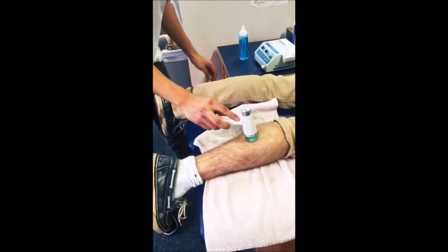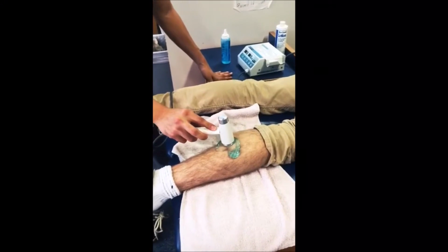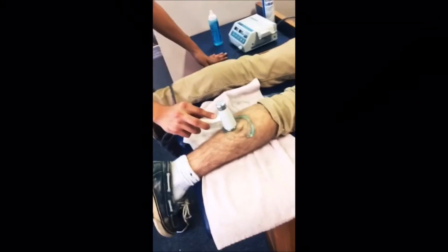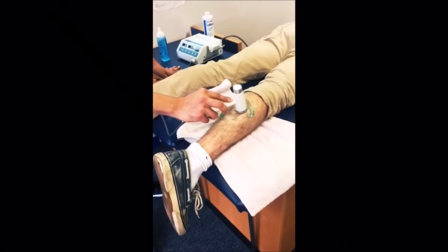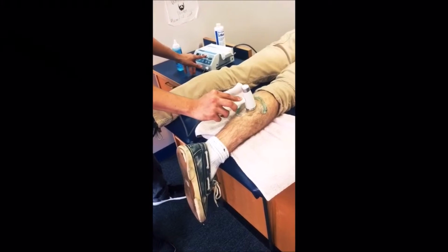Place the transducer head on the patient and start treatment. Be sure to always move the transducer head in small circular motions along the area you wish to be affected. Remind the patient if they are ever uncomfortable throughout the treatment to let you know. Intensity may be raised in accordance to how fast you want effects to appear.